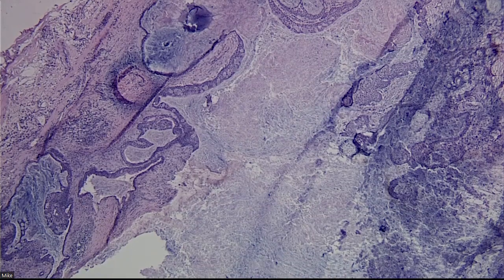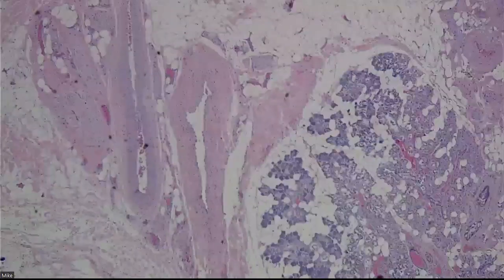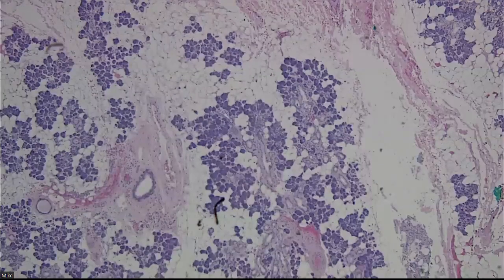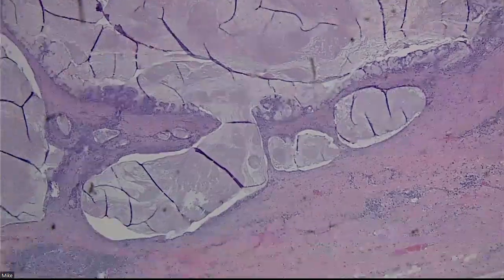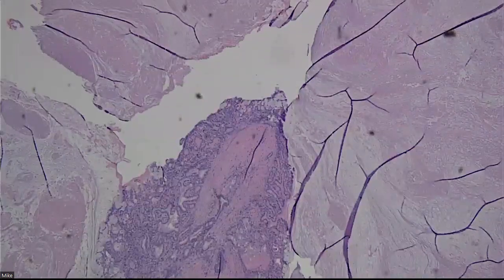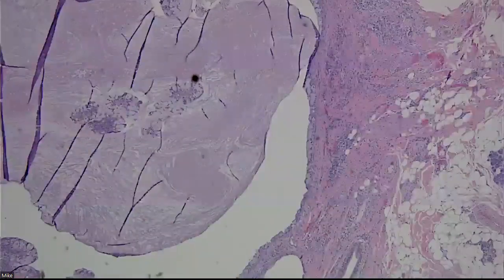So squamoid, or kind of squamous intermediate, and then mixed with mucin. All of the non-mucinous cells in mucoep are essentially of some squamous differentiation, and so they stain with things like P40, P63, and high molecular weight keratins, right? So they do appear squamous or squamoid. We talk about squamous, intermediate, and mucinous cells of mucoep, right? The squamous component of a mucoep is often not overtly, heavily keratinizing mature squamous. It's often this kind of immature squamoid appearance, which is, I think, what you picked up.